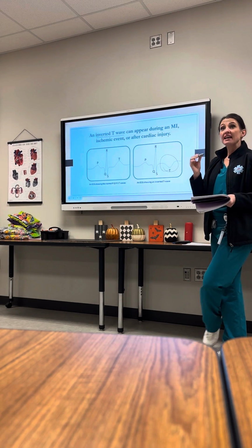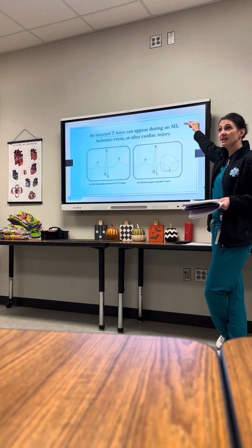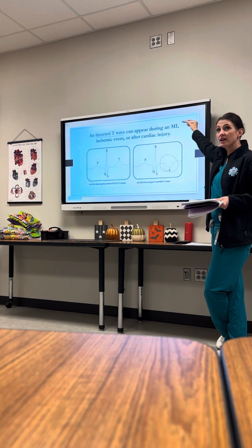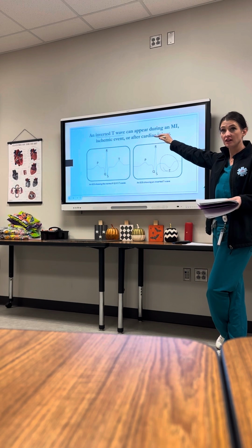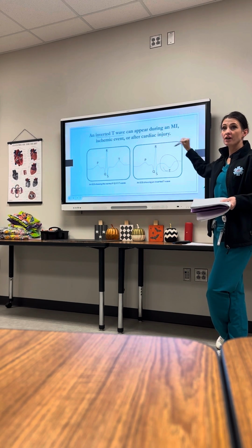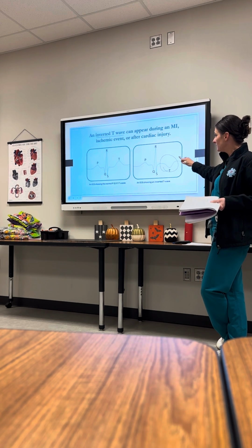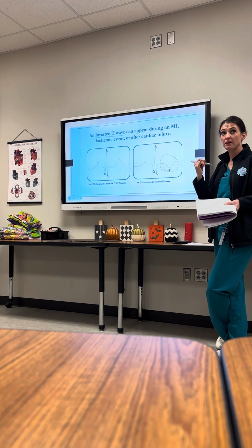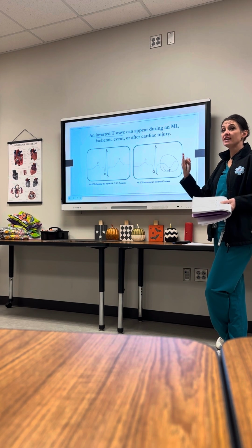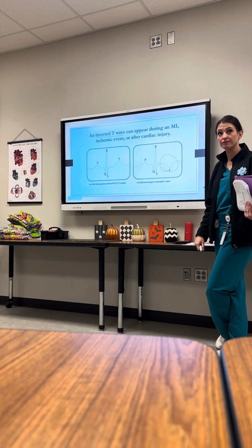And I want you to write down, an inverted T wave can appear during an MI. What does MI mean? Myocardial infarction. Myocardial infarction. An ischemic event, and we'll define ischemic here in a second, or after a cardiac injury. Okay, so if I have a patient presenting with this inverted T wave, it could be signaling to me as the technician that this patient is having a myocardial infarction, an ischemic event, or has had a previous myocardial infarction or injury of the heart that they've recovered from, okay?